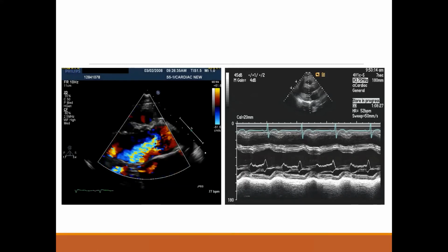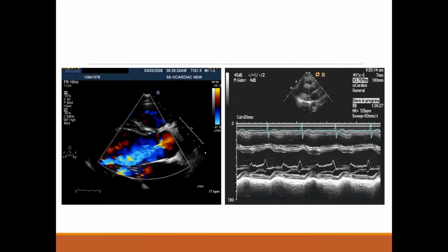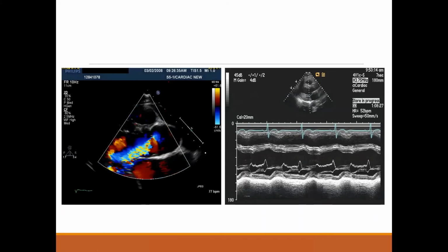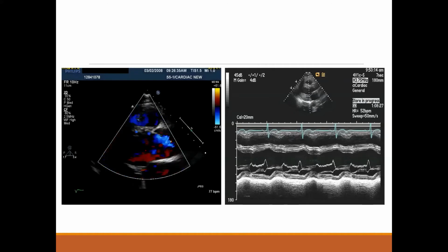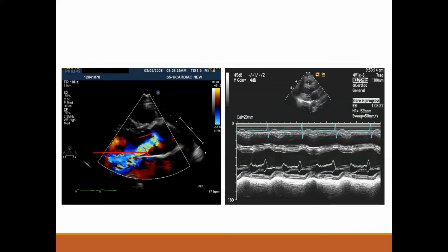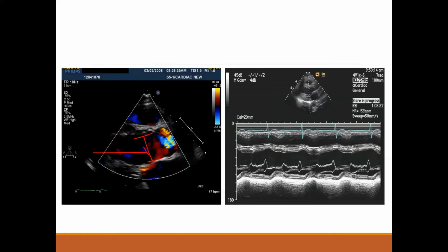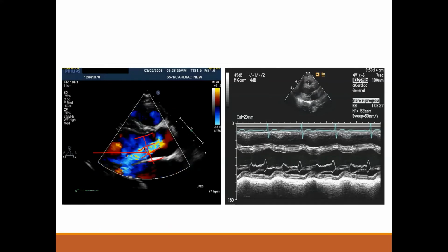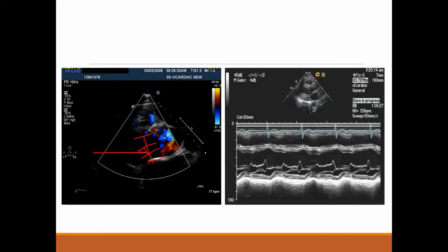But you will definitely, and it's good to tell me that you are going to go for a quantitative measure like vena contracta, and if it's more than 0.6 centimeter it indicates severe. Okay, even if the LVOT jet is more than 65% filling of the LVOT, this also indicates severe. So if you look randomly at the jet here, it is probably something around 60 and more.